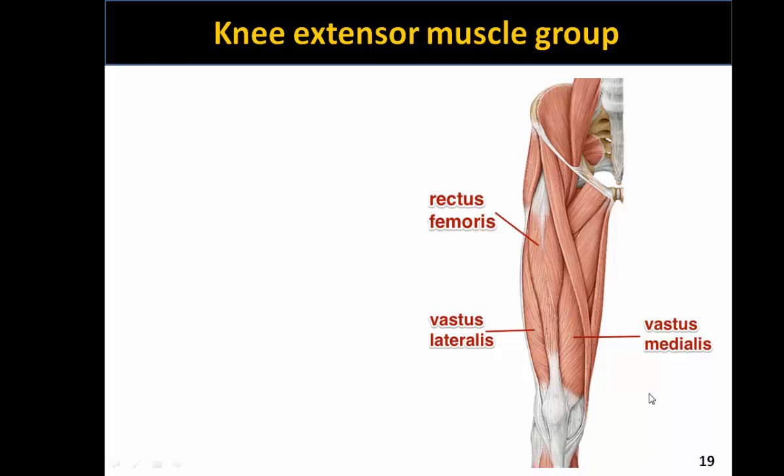In this final part, part 4 of our EMG module, we're going to start by conducting a very brief review of the knee extensor muscle group, because it's this muscle group that will be used as an example of how the EMG signal can be used with motion and force data to get a better understanding of human biomechanics.